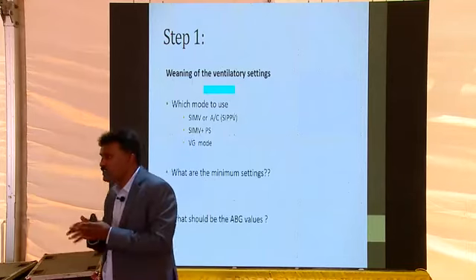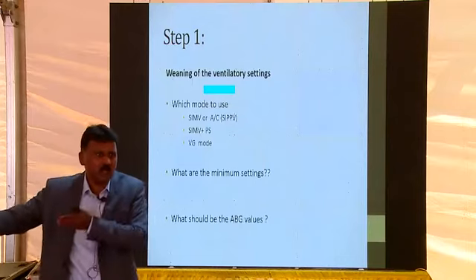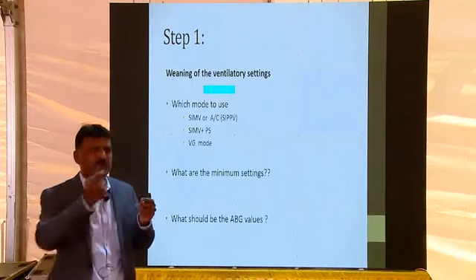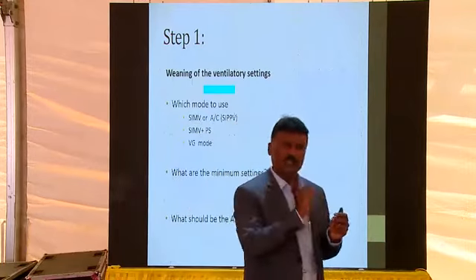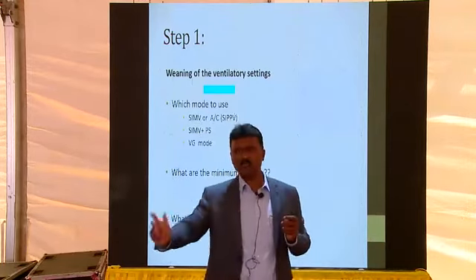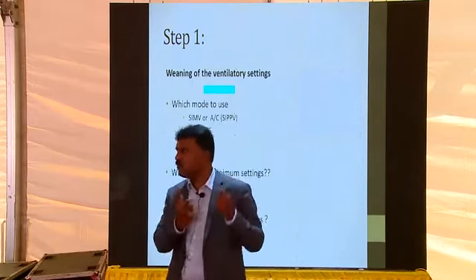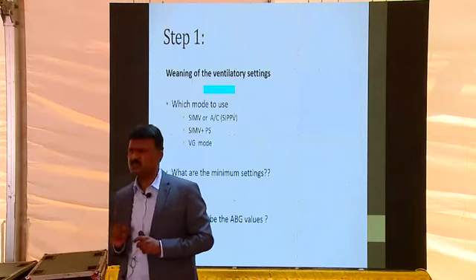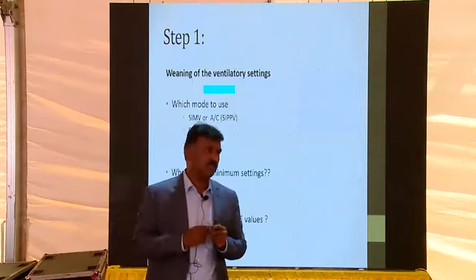People who are in favor of SIMV feel it's easier to wean him off because you're giving him that autonomy to breathe. Only thing is, maybe because he's breathing through a narrow ET tube, it does increase the work of breathing. But people feel that is what I want. I want to see him breathe 40 breaths on his own with increased work of breathing.